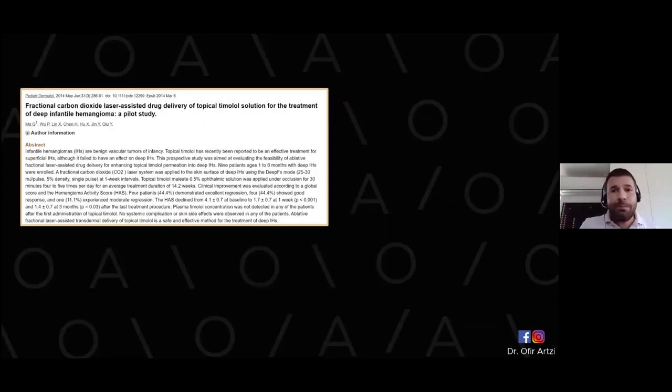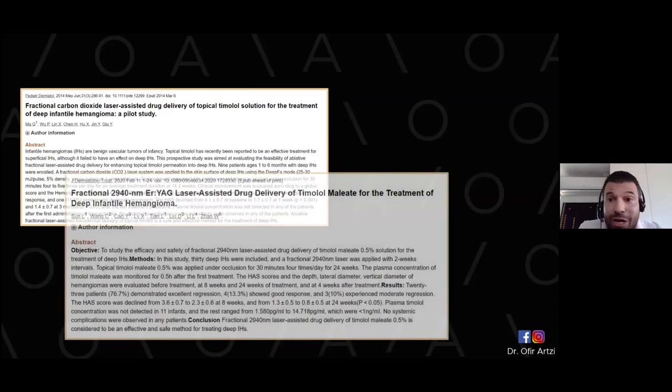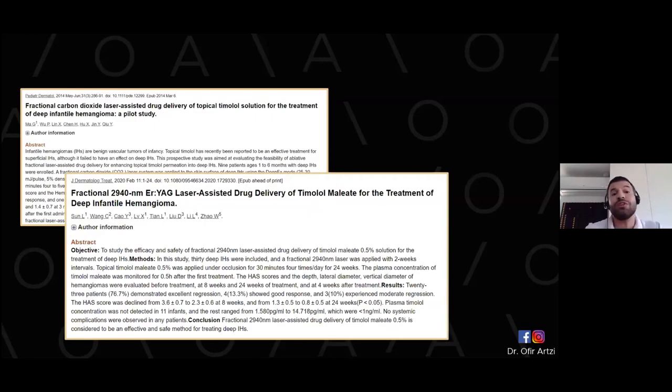So let's take it one step forward. Let's talk about energy-based device assisted delivery of timolol. We weren't the first ones to think about it. This is a study from 2014, CO2 laser-assisted drug delivery of topical timolol. It showed very nice results for the deep infantile hemangioma component. This is another, relatively new study, February 2020, on fractional erbium YAG laser-assisted drug delivery of timolol. Again, nice results for deep infantile hemangioma.